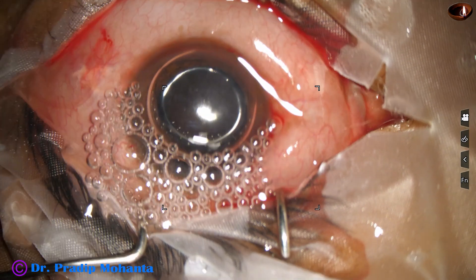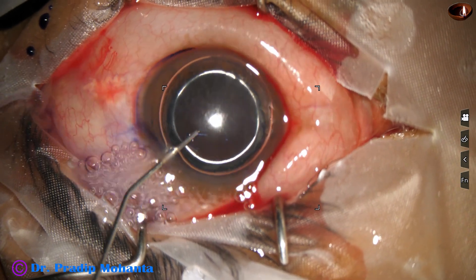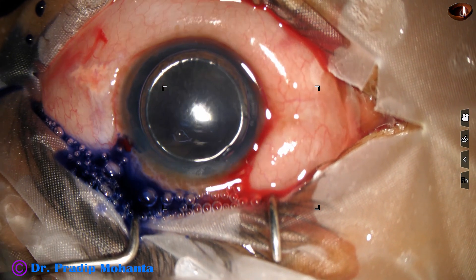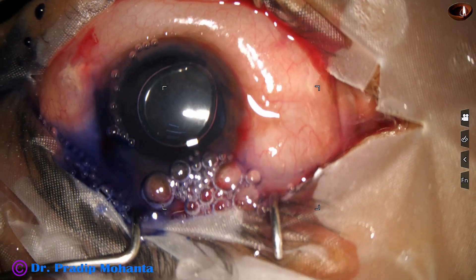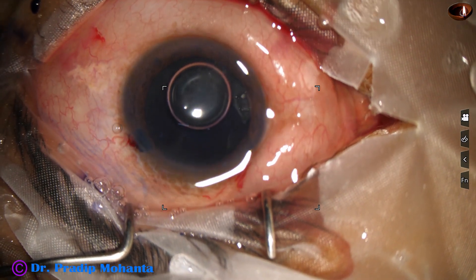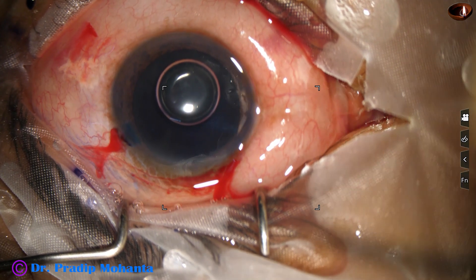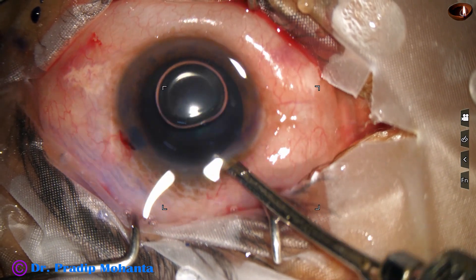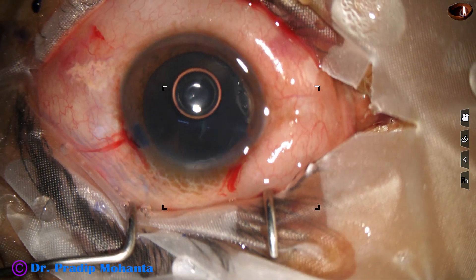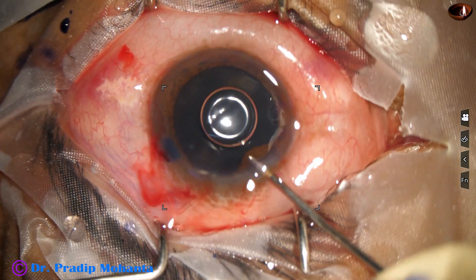An air bubble is injected to fill the anterior chamber. Beneath this air bubble, trypan blue dye is applied over the anterior capsule. This is adrenalin. Phenacaine has also been applied so that we get some more anesthesia. Intracameral lignocaine has been used. Along with that, there is tropicamide and phenylephrine to keep the pupil dilated. In hard cataracts, if we get a dilated pupil, management becomes comfortable.